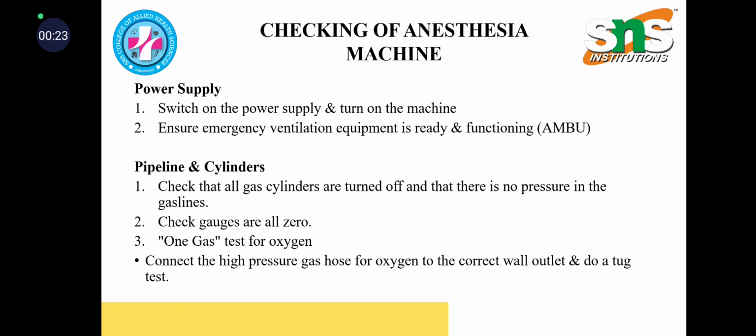So the first comes under power supply. Switch on the power supply and turn on the machine. Ensure emergency ventilation equipment is ready and functioning, AMBU, Artificial Manual Breathing Unit.